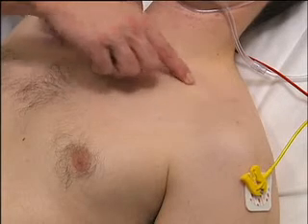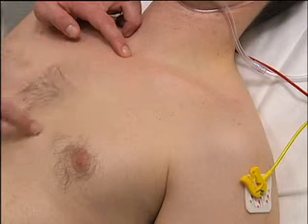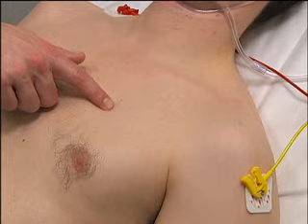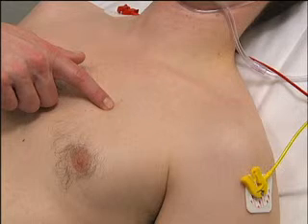Next, identify the middle of the clavicle and the mid-clavicular line. The intersection of the mid-clavicular line and the second intercostal space is the correct place to insert the needle for aspiration of pneumothorax. It can be helpful to mark the needle insertion site with a skin marking pen.